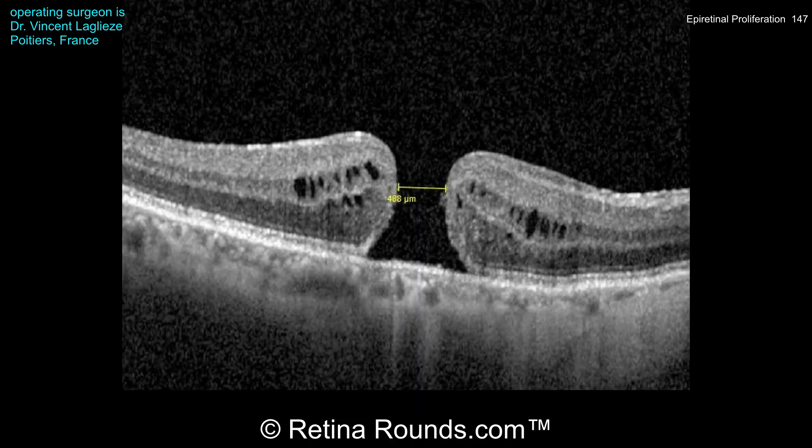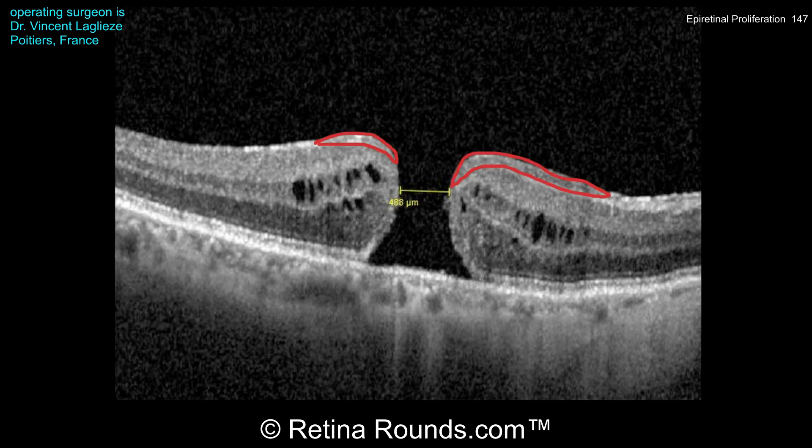The preoperative OCT demonstrates a full thickness macular hole with a minimum linear diameter of 488 microns. The macular hole index is greater than 0.5. There is an elevated cuff and perifovial cystoid changes — features all associated with a higher likelihood of macular hole closure. But if you look carefully at the inner surface of the retina adjacent to the hole, you'll see a thickened layer with medium reflectivity, which represents epiretinal proliferation.